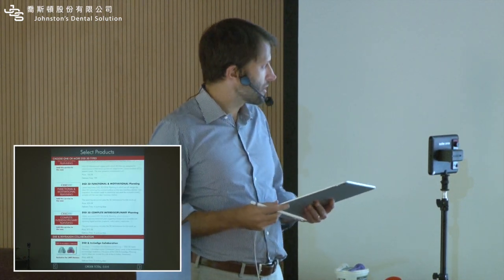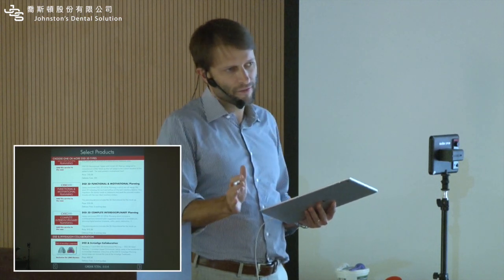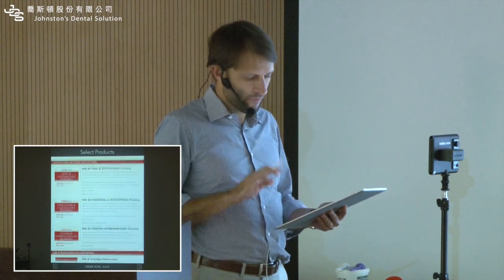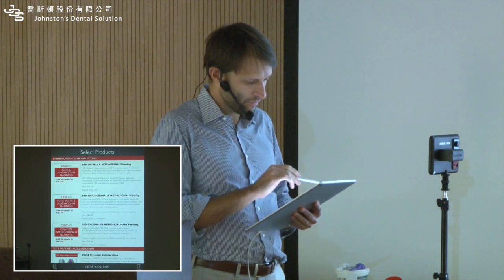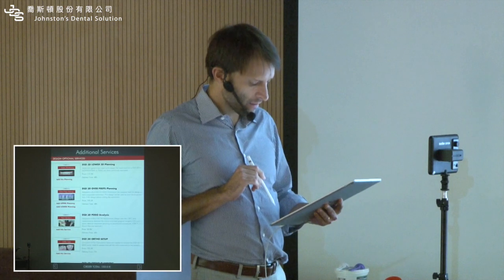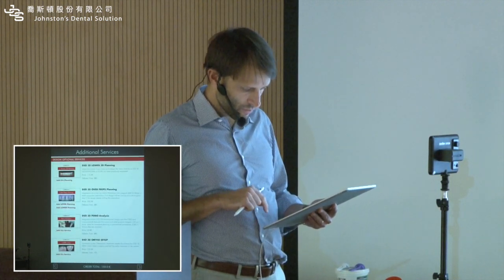Invisalign collaboration is for the ones that already know that it's going to be a restorative Invisalign case. And there's a complete different pathway, but let's start easy. Just try a case with the first. You add, you go next. If you want to add something else, no, just go simple.